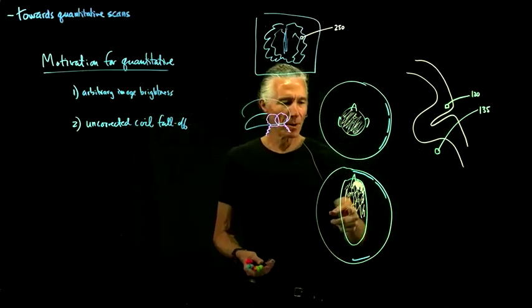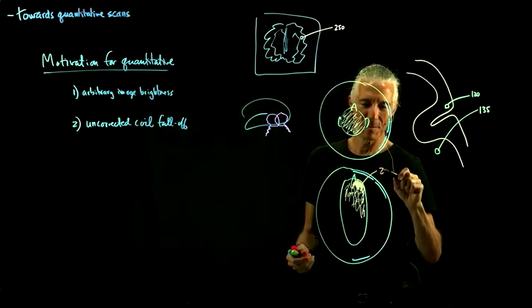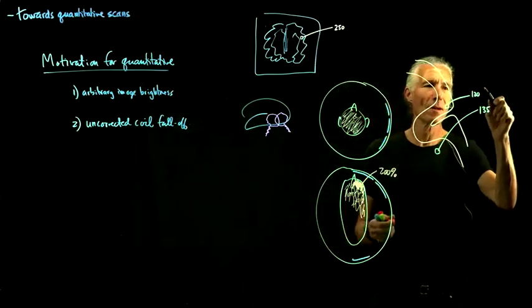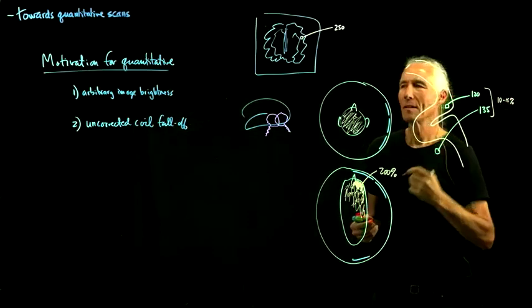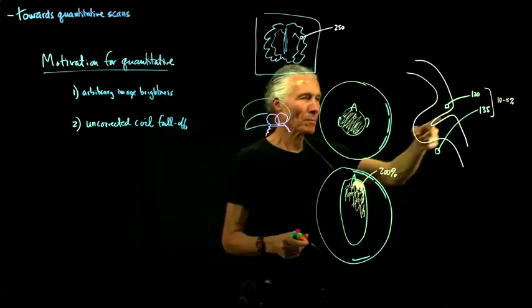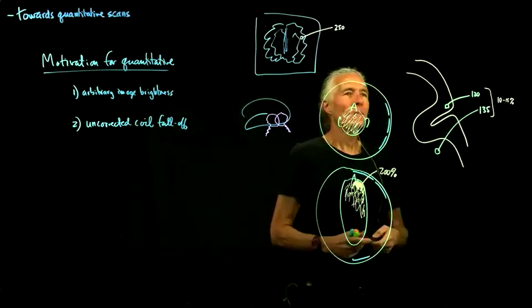So compare that to this 200% brighter. Okay. So the gray matter and white matter might be 10 to 15% on a good day, depending on your pulse sequence. So that's okay. That's a reasonable amount of difference in order to distinguish gray and white matter. But what about different areas?